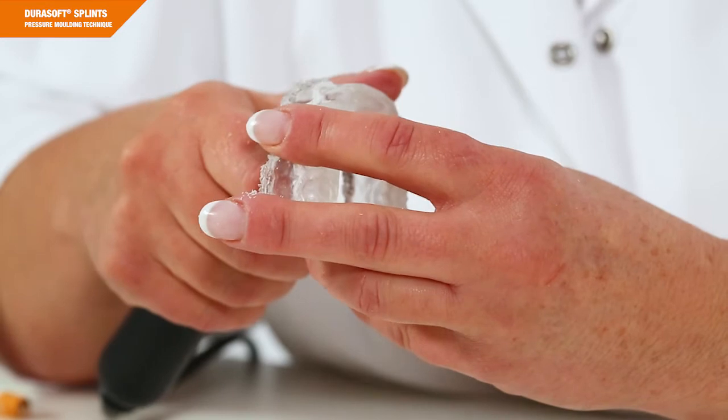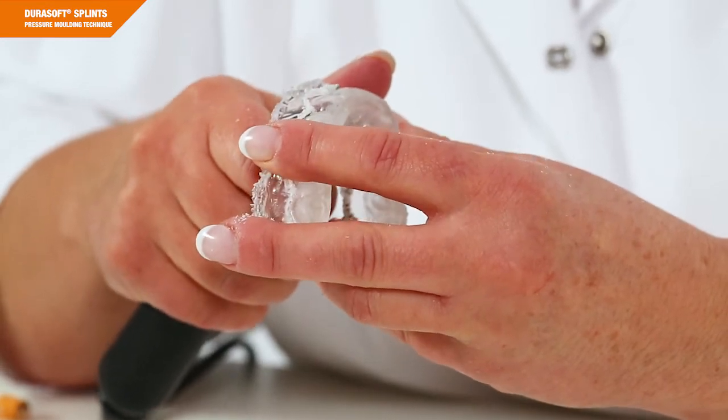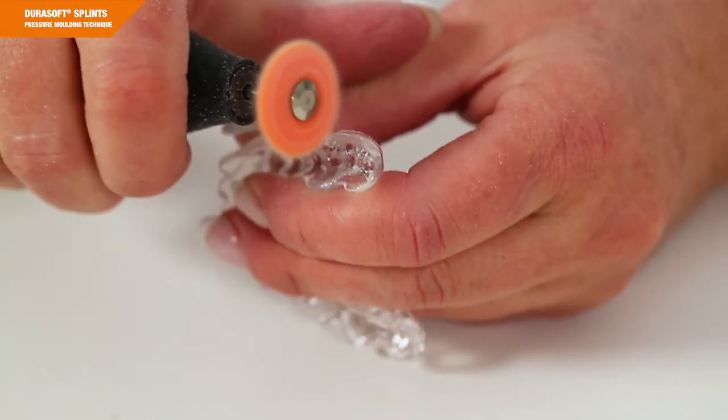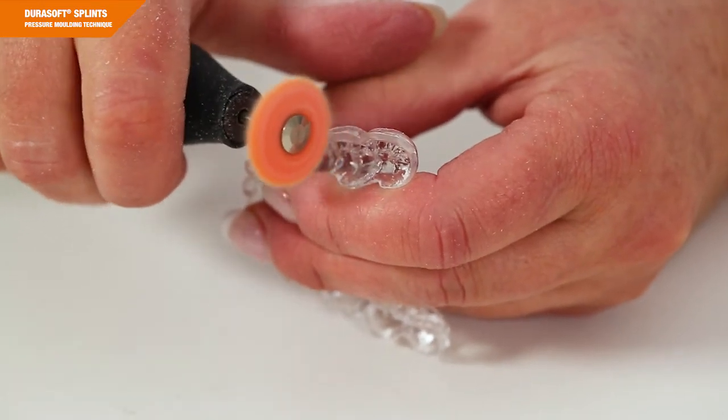Place the splint in a pressure pot for curing. Please adhere to the fixed polymerization time, the pressure, and the water temperature. In case of larger adjustments for frontal and canine guidances, a silicone matrix might be helpful. Once polymerization is completed, the DuraSplint adjustment is finished, for example with LC burrs, and then conventionally polished. To minimize residual monomer, we recommend placing it in water for several hours.